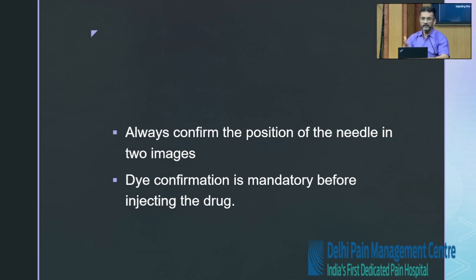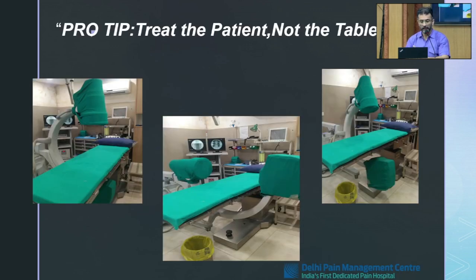Third, these are the golden words of my teacher, Dr. Dhruv sir. He said, putting in a needle is not the final thing, getting a good dye spread is the key. Wherever there is the dye, there is going to be drug. So getting beautiful needle positions is not the point. Getting the good, perfect dye position is what we are looking for. With that background, let us start with the images.